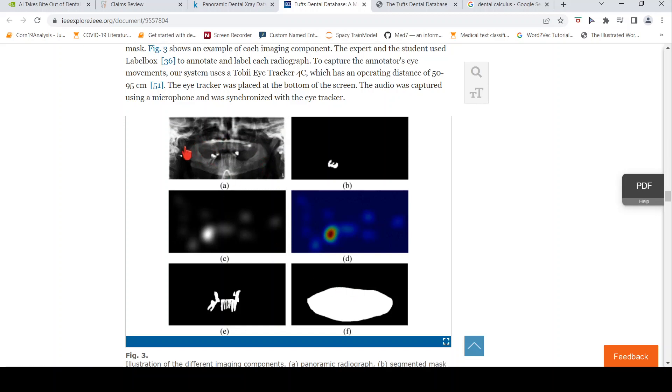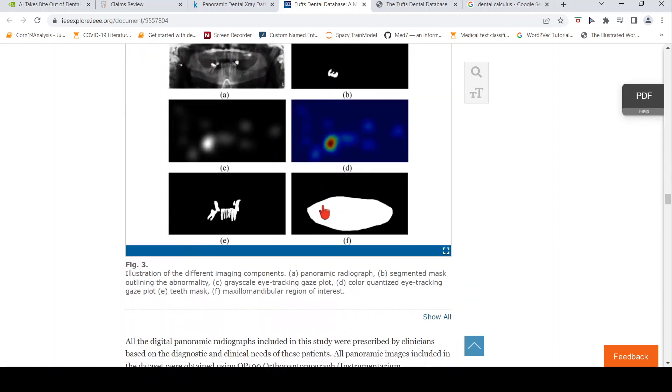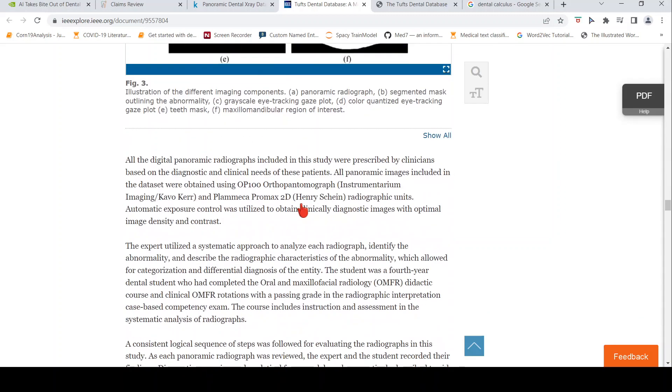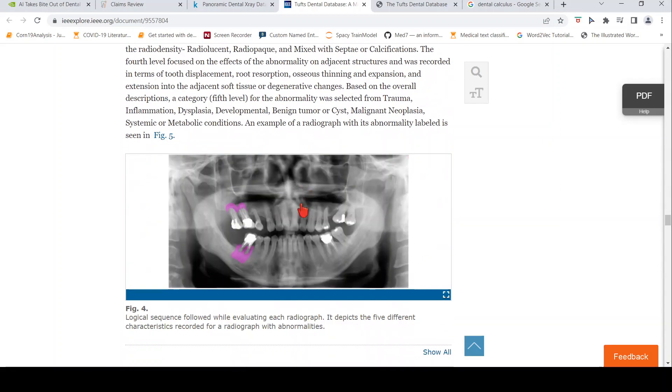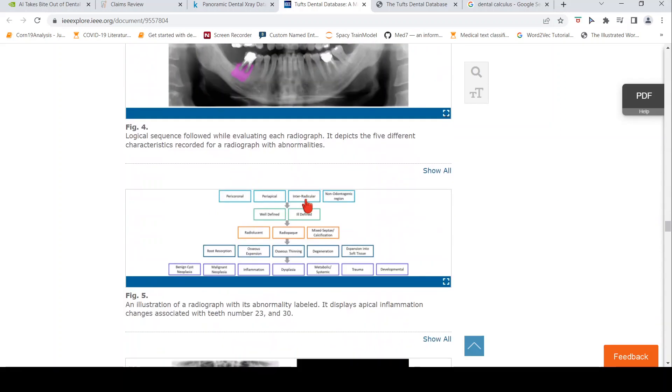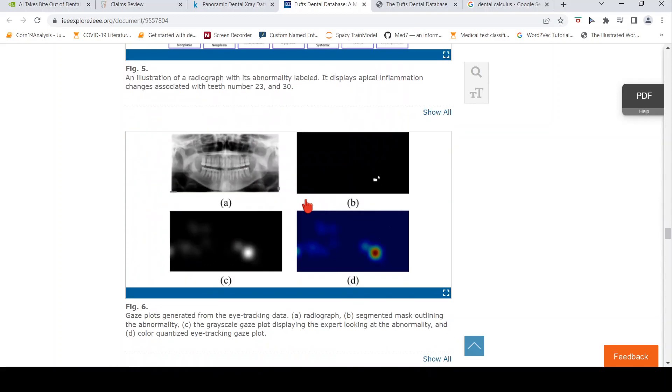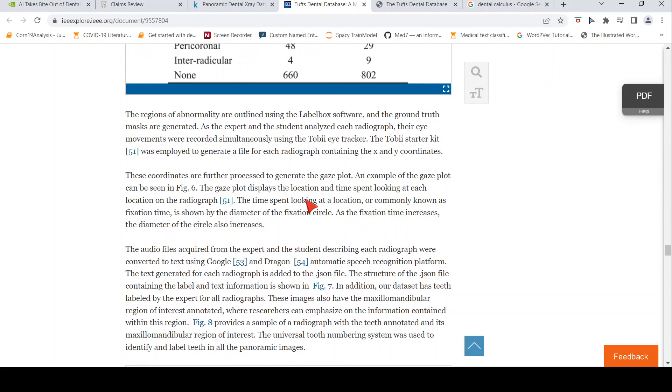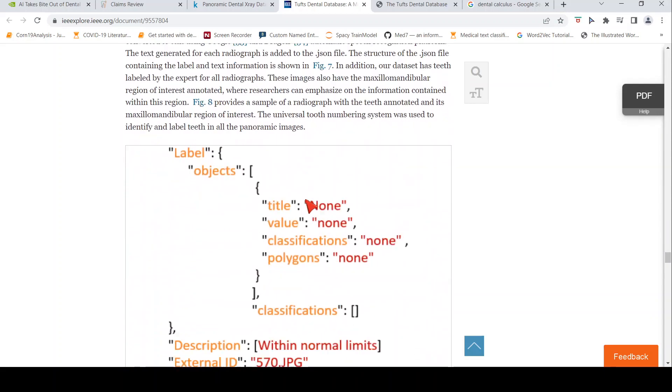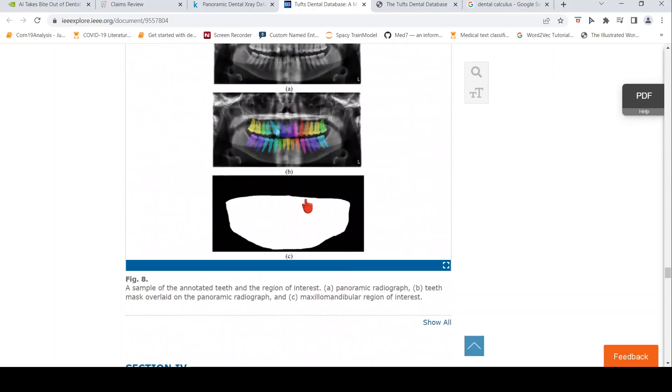This region, your gums and entire teeth, they have the maxillomandibular region of interest. They have the mask around that region as well. And they also have a JSON file for each of these. They have three JSON files for each of these files. That's how they have organized it.